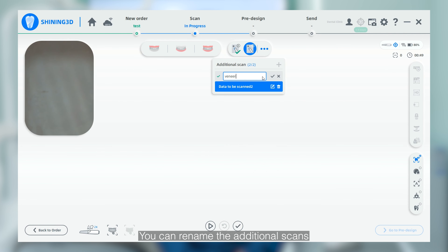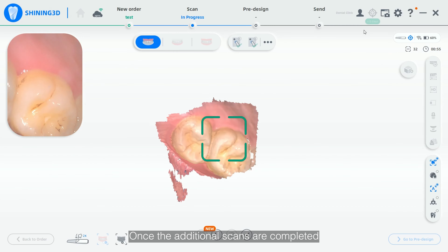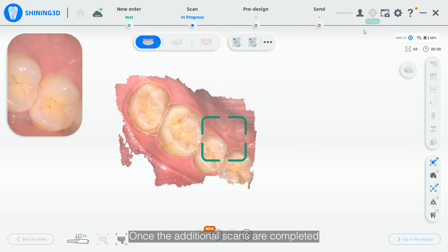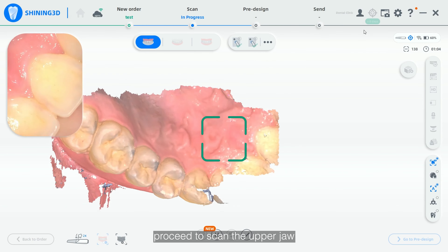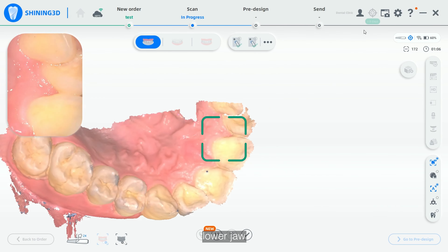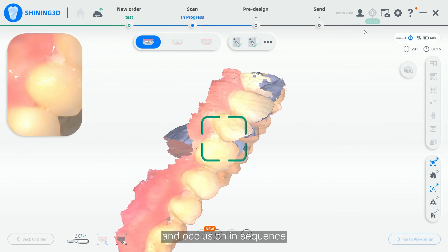You can rename the additional scans, and the maximum number of additional scans can be up to 10. Once additional scans are completed, proceed to scan the upper jaw, lower jaw, and occlusion in sequence.